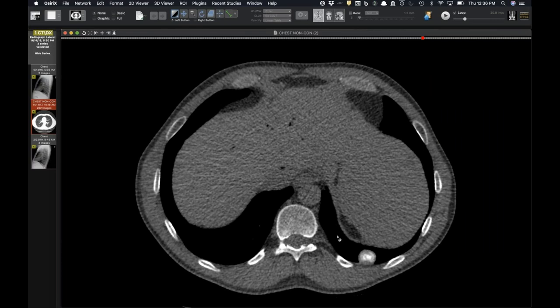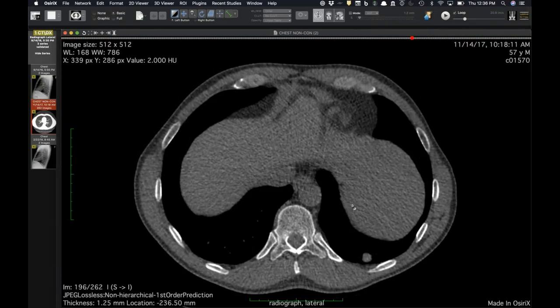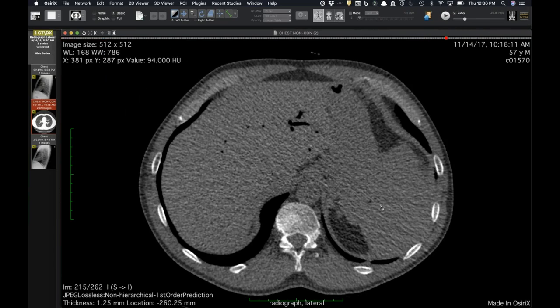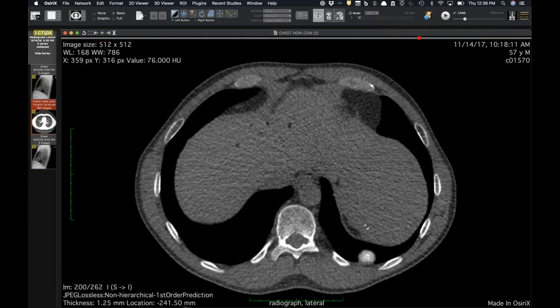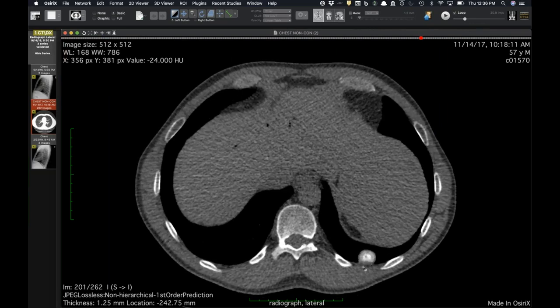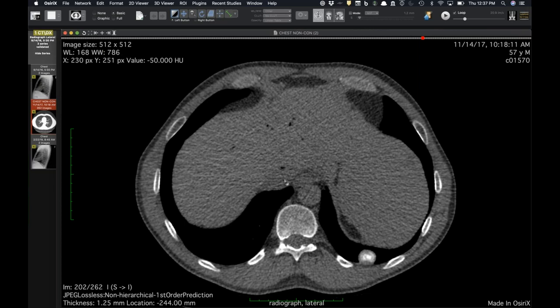That's very typical of what we see with histoplasmosis - or in your neck of the woods, coccidioidomycosis. Usually we don't see just solitary calcified coccidioidomas. I looked at the spleen and liver and didn't see anything. I love the targetoid calcification - this one has a little lamellated calcification around the periphery and more discrete calcification targetoid in the middle. So it has both. Just a fun one - an obvious blind spot on laterals.